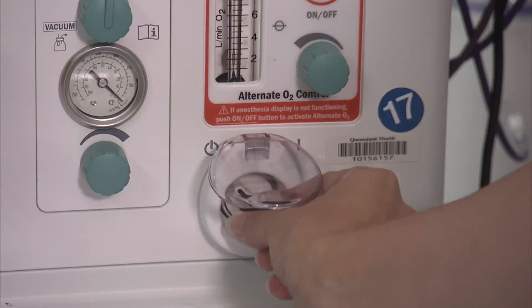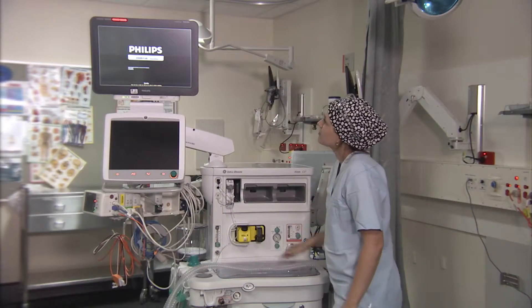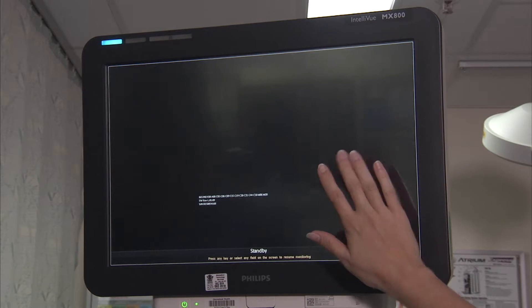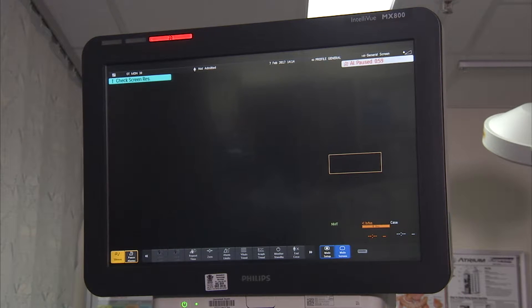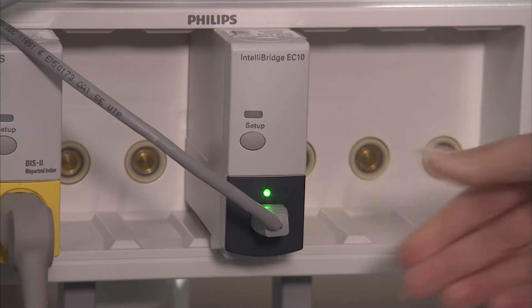Firstly, turn all the anaesthetic devices and monitors on, ensuring the Philips MX800 is connected to the Philips EC10 module within the module station.